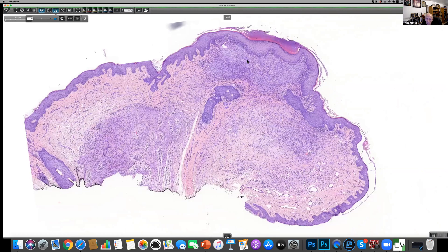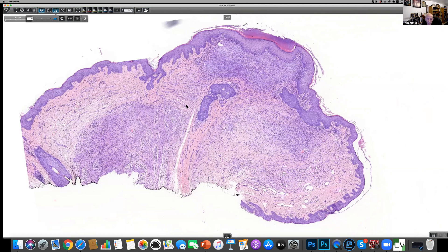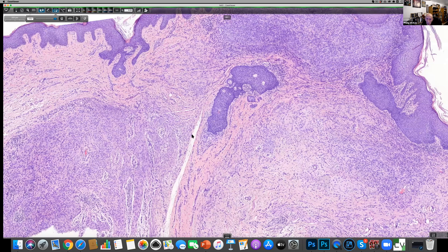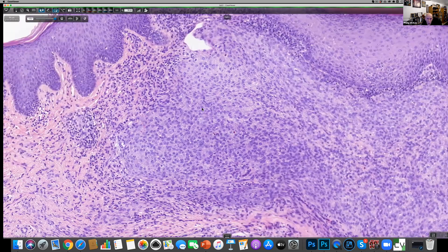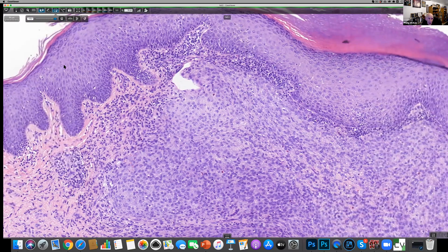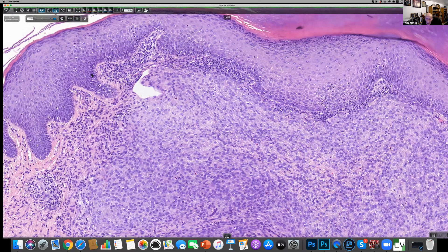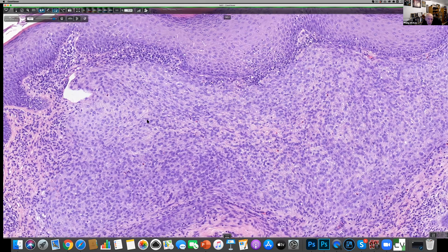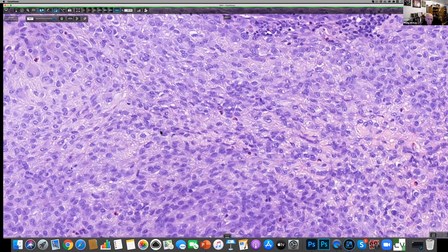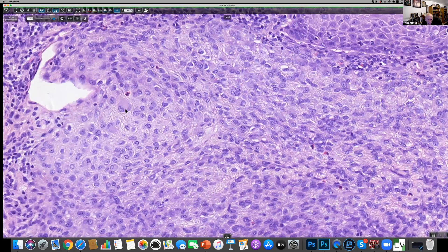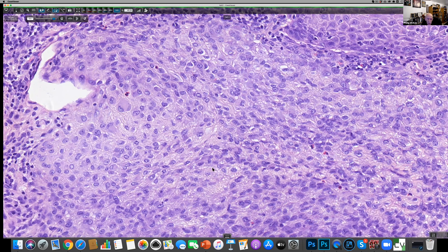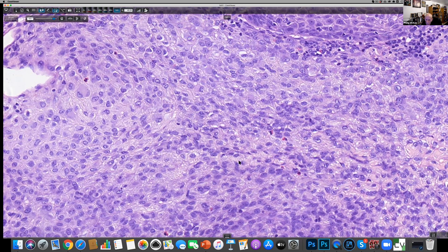We have multiple nodules of tumor. Up at the top, you can see there's a dense infiltrate of fairly uniform cells with obviously very abundant cytoplasm and round to oval nuclei with small nucleoli. There's a cell with a sort of ground glass cytoplasm. One of the thoughts you would have to think about in a lesion like this is whether it might be melanocytic.